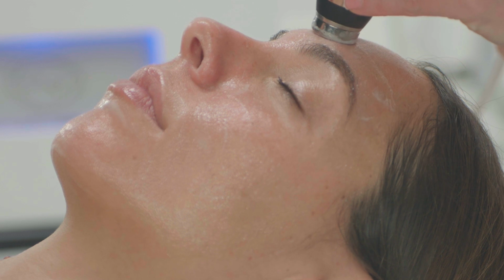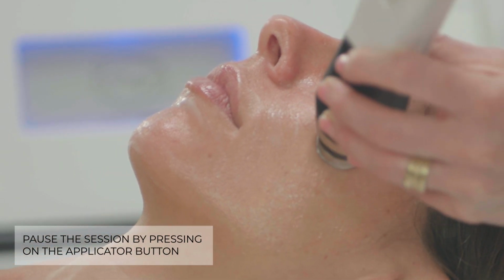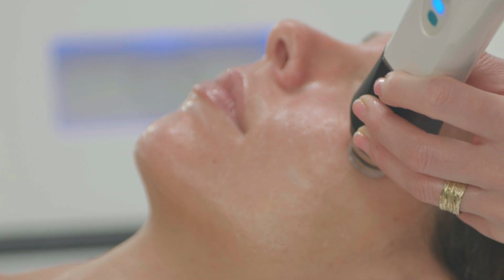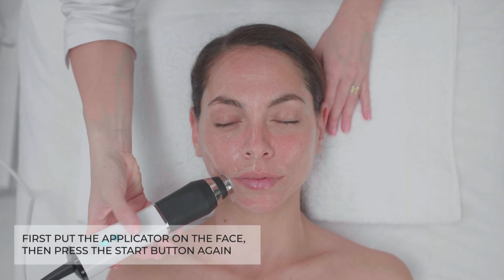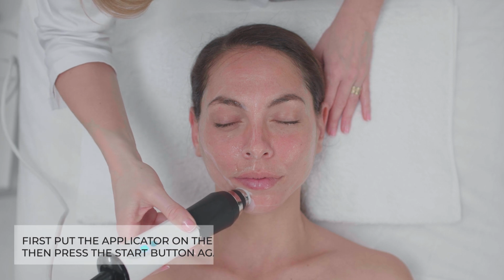If you want to adjust the parameters, pause the session by pressing on the applicator button before taking off the face and adjust parameters on the treatment screen. To restart the procedure, first put the applicator on the face, then press the start button again.